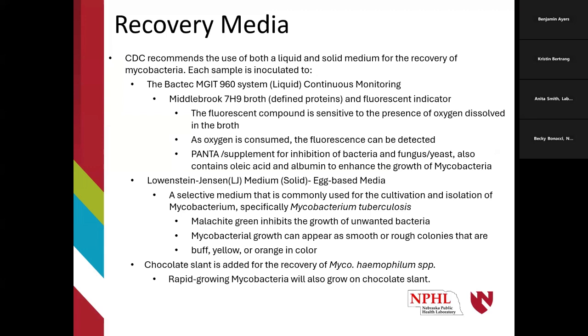We also add a supplement, PANTA, which is a combination of antibiotics and antifungals. We also have a supplement which contains oleic acid and albumin. Of course, albumin is a protein source. Our solid media that we routinely use is Lowenstein-Jensen, and that's an egg-based media. It is somewhat selective. It has malachite green in it, which for some reason inhibits the growth of bacteria.